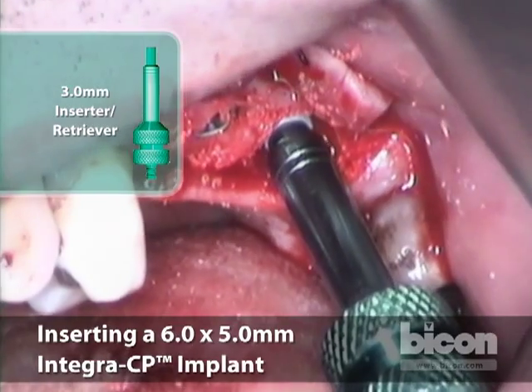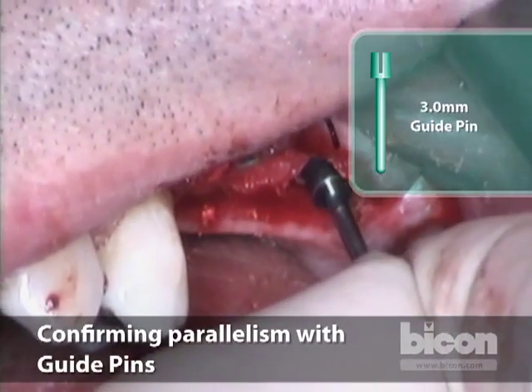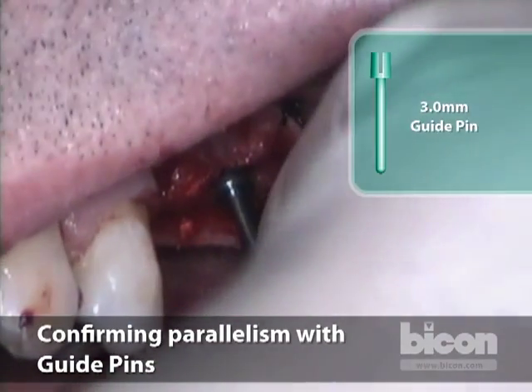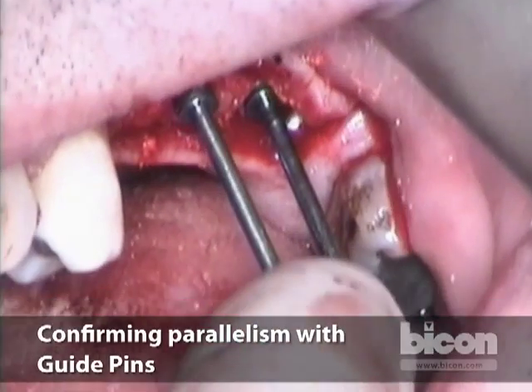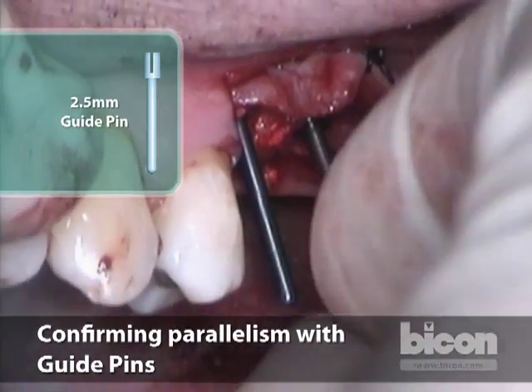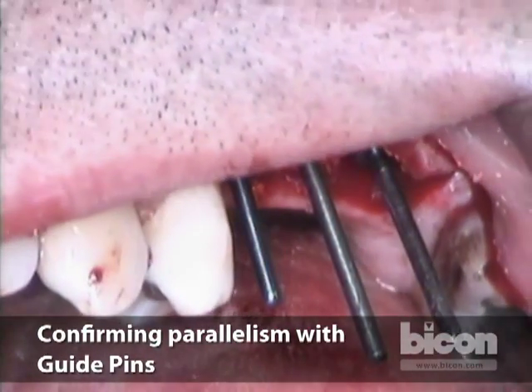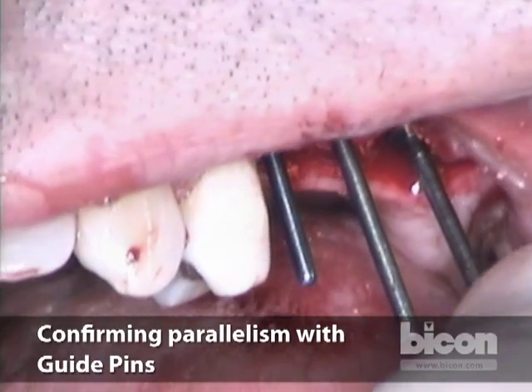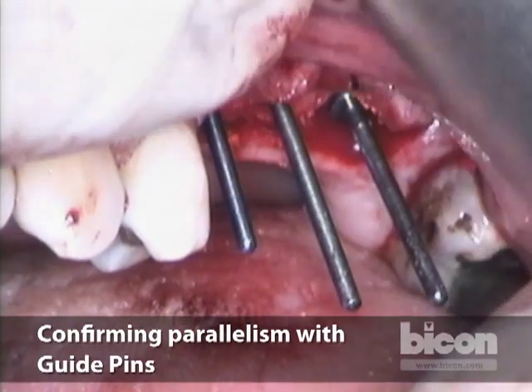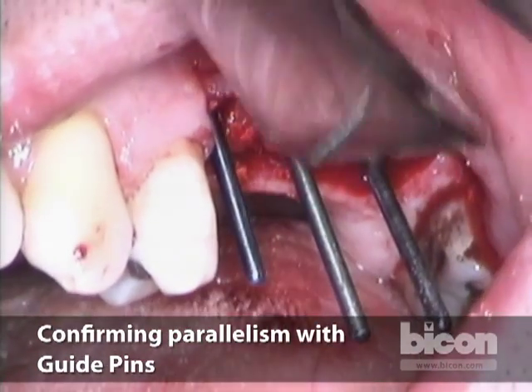We seat it. I'm happy with that seating. We will double-check the angulation before we seal them, using guide pins which are designed to give us access and indication as to where the implant is upon uncovering. We use them now because this is the last chance to control these implants before they heal. The second molar implant is slightly angled, but that's okay — we can fix it.